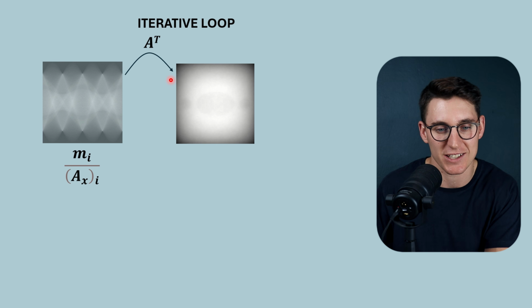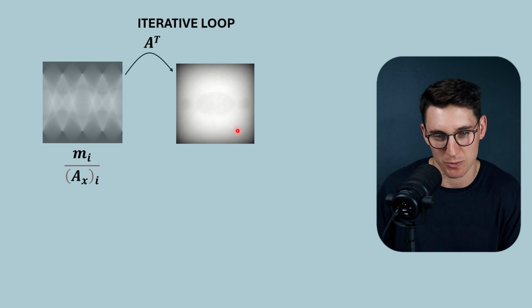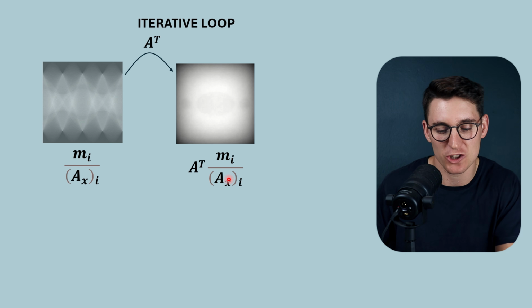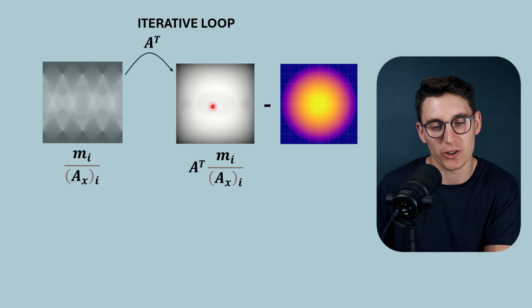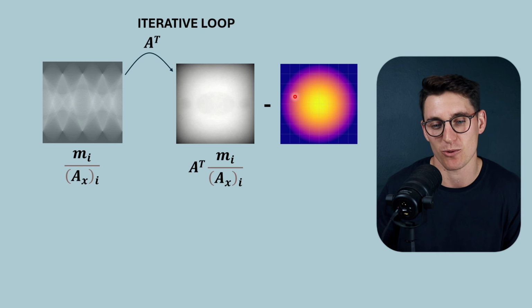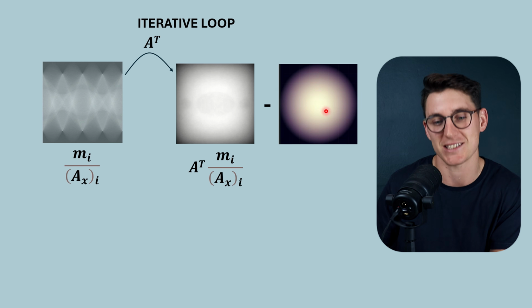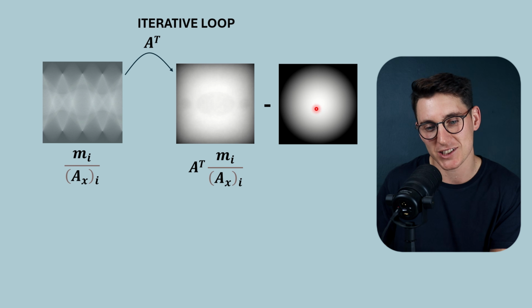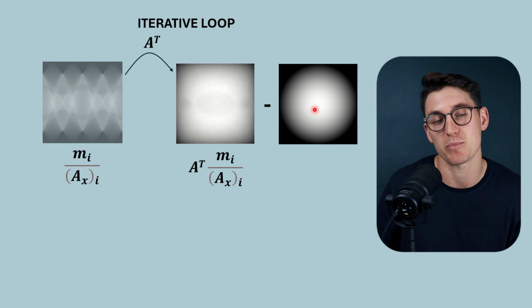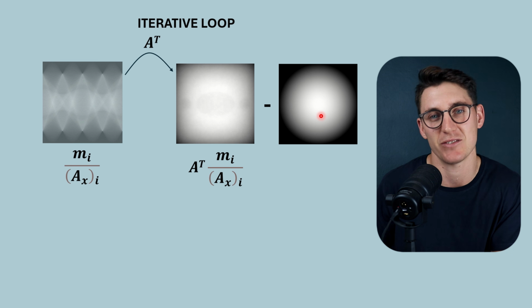What that's going to give us is a spatial domain image that represents essentially a back projected image of the ratio between our measured and our predicted sinograms. Now, I said to you before that depending on spatial location, we're going to get differing exposures because of the rotation of the CT machine around the patient. And we can create what's known as a sensitivity image. We want to take out those differing exposures from this image that we've created. We only want to see true differences, not differences based on exposure. This is what's known as the sensitivity image.